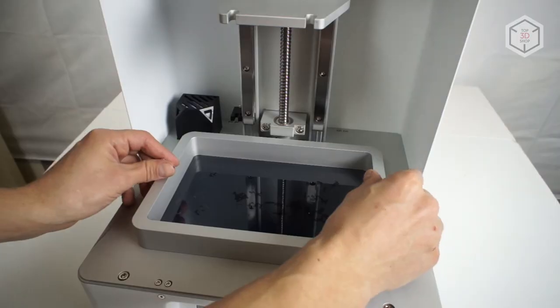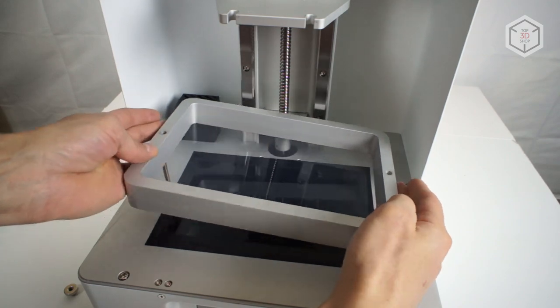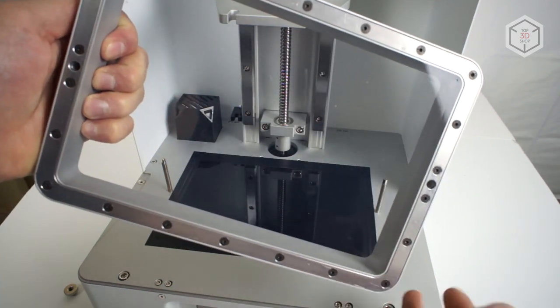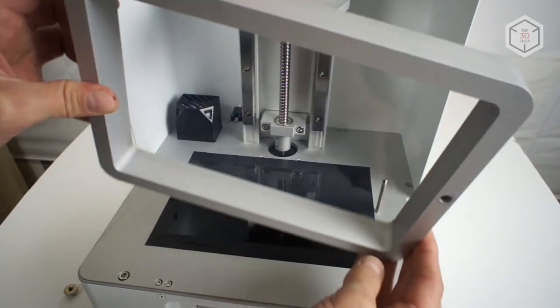Nothing special. The vat in the basic model is quite mediocre for these types of machines. Made of aluminum, it does not have a cutout for draining the resin and a max mark, which usually indicates the necessary resin level for it not to leak out when the platform is immersed in the vat.